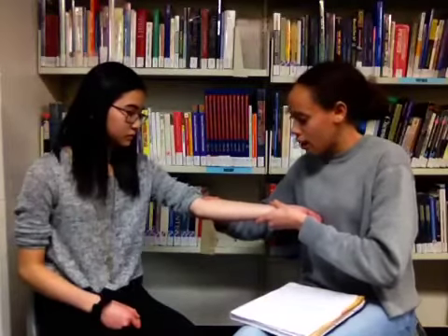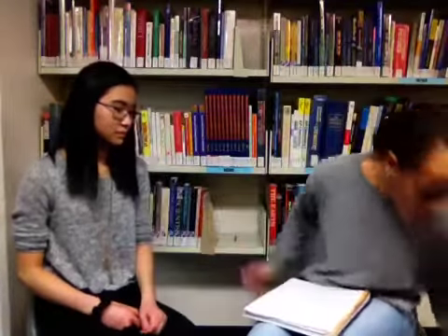The last vital sign I'm going to be taking is blood pressure. First you want to find the pulse. Once you find the pulse, place the cuff just above it.